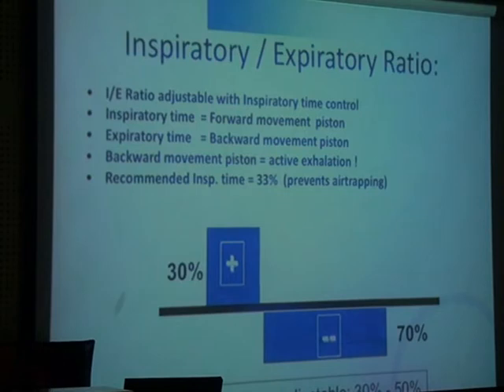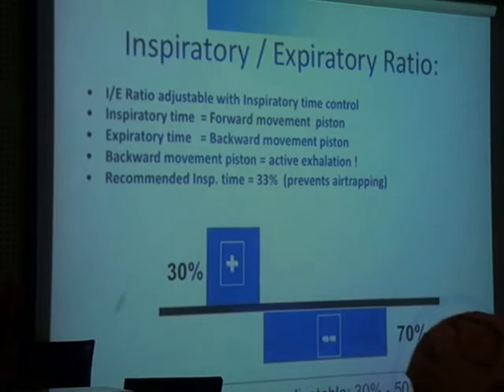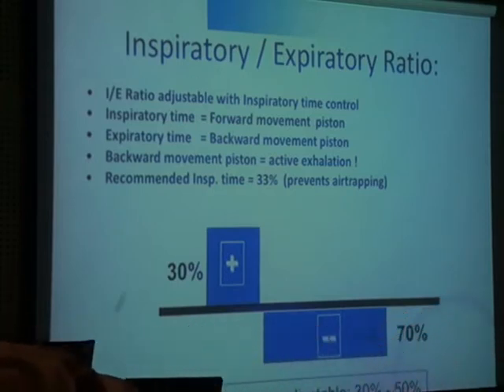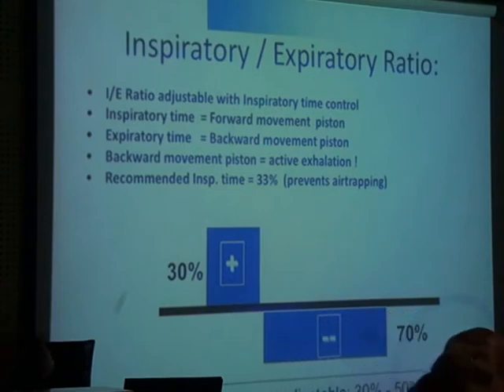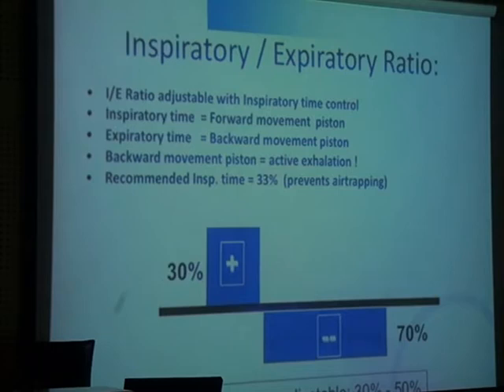Just being honest with you, we learned back probably in the early 80s that a 1-to-1 IE ratio was associated with higher intraventricular hemorrhage. We were worried that because of the fast rates and the 1-to-1 IE ratio, they were air trapping, and so your mean airway pressure was actually being almost doubled in your patient's lungs. People shied away from that after those initial animal studies because they decided that the 1-to-1 IE ratio was a little bit problematic.